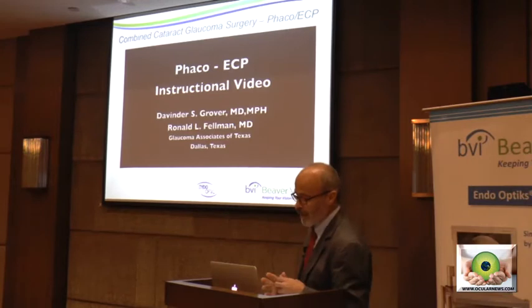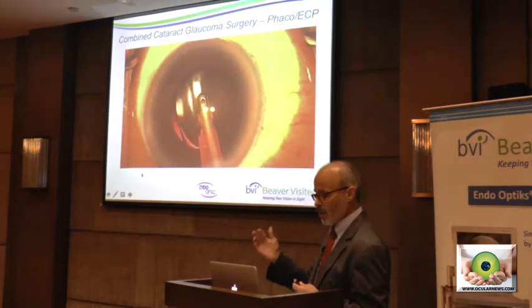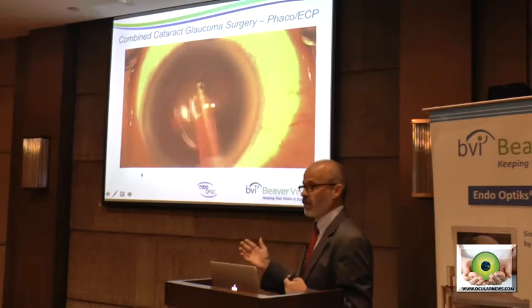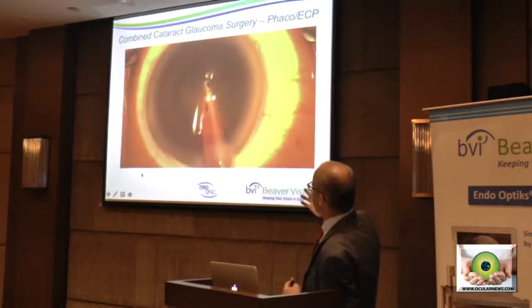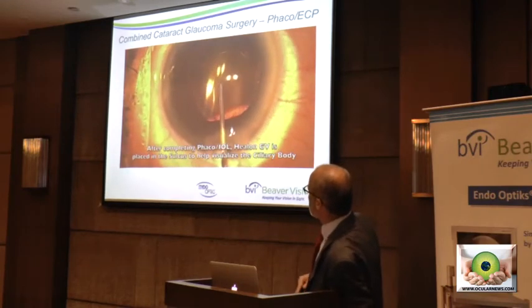So this is a quick film, and I'll go through it quickly because there are a number of more slides. But I wanted to show you a complete procedure from A to Z. Here, the phaco procedure is being completed.